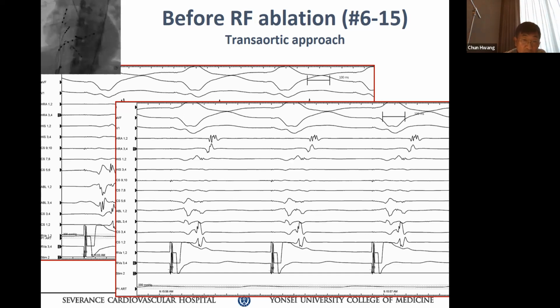그럼 catheter 조금 더 움직였어야 되겠지? Remember, we discussed this in ERC. Your ablation catheter, bipolar, field of recording is 8 millimeter. Okay? Your RF lesion only 3 millimeter. If there's an error of a 4 millimeter, you can make ablating there. That's why you really have to make sure that your distal tip of ablation, which is unipolar ablation, is within the range of your pathway. That's why you need a unipolar signal. Look at it. In this circumstance, would help you which way to go. Okay? Okay.